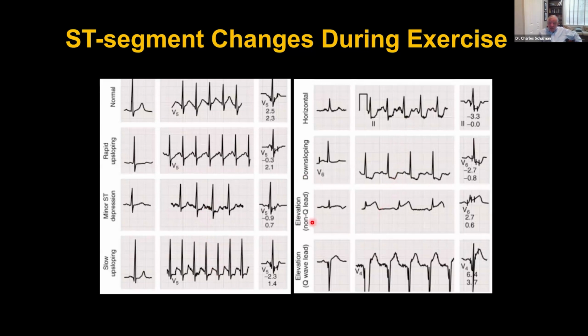Also, ST elevation in a non-Q wave lead or aVR, right? So, ST elevation in aVR on a stress test should raise the possibility that you're dealing with severe three-vessel disease.